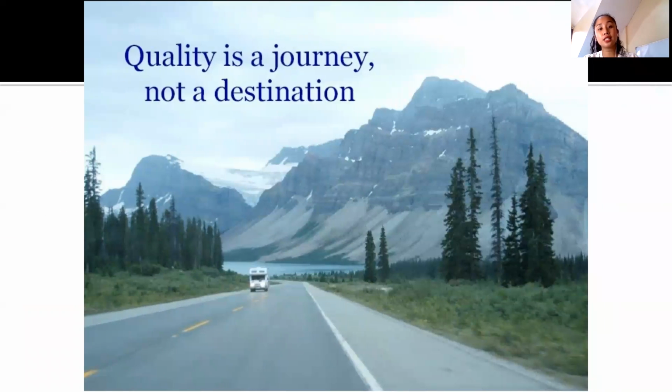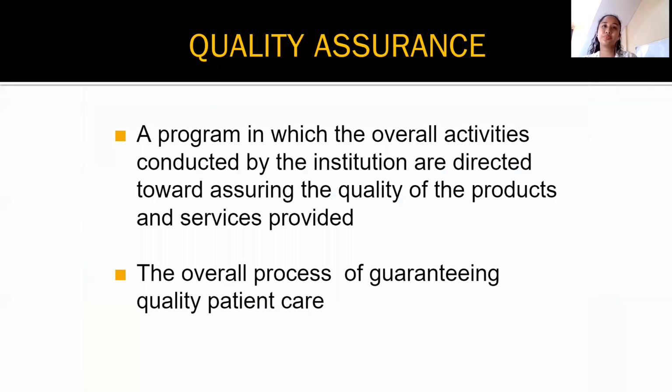And quality is a journey, not a destination, meaning all throughout the process of laboratory testing, we ensure quality. So class, during the collection of the specimen up to the processing of the specimen up to the release of results, we are applying quality control techniques. Hindi lang natin chine-check ang accuracy ng test pag tapos na. Simula pa lang ng laboratory process, we are already ensuring quality. So it's a journey, not a destination.